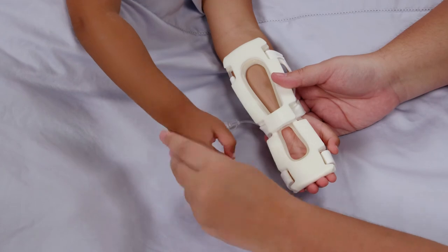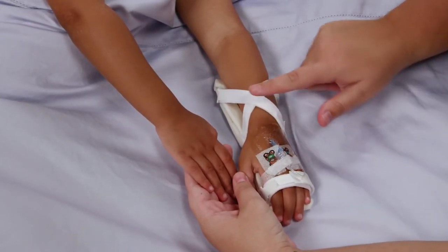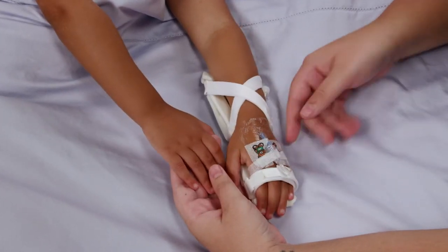It should feel soft, warm, and dry. Look at the site and check for signs of leaking IV fluid, and then compare the extremity to the opposite side to check for any swelling.